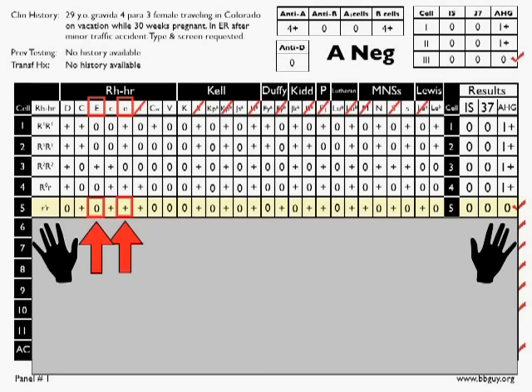Slide over, same sort of argument with big C and little c, except in this case, we have single dose expression of both big C and little c. Now, there are some immunohematologists who will put a horizontal slash through both little c and big C in this instance, just to show, hey, we've done a heterozygous or a single dose rule out based on big C and or little c. I personally don't do that.